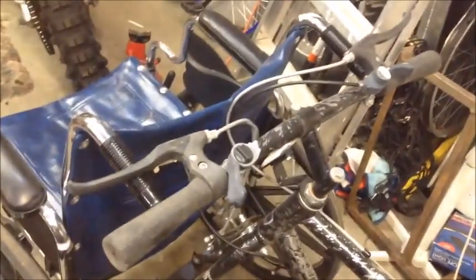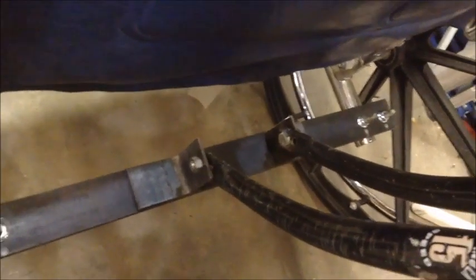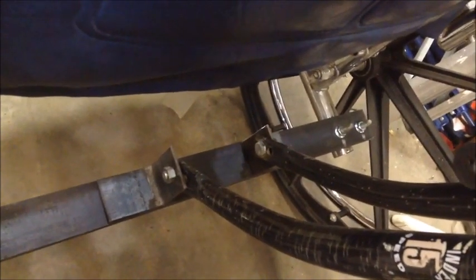Alright, so you can see we've got our forks mounted down on the little plate. I got the plate clamped on using the U-bolts, and now I'm just going to measure to have the distance the same on both ends so that the forks are centered on the steel plate. Close, you know, just somewhere in the area. Doesn't have to be to the 100,000ths of an inch. If we get it within 3/8 to a half an inch or less, that's great. So that'll be the next step, and then once those are in place, we'll throw a C-clamp on them and weld them there, and that'll be where they'll mount. Then we'll get on to modifying the frame of the bicycle.